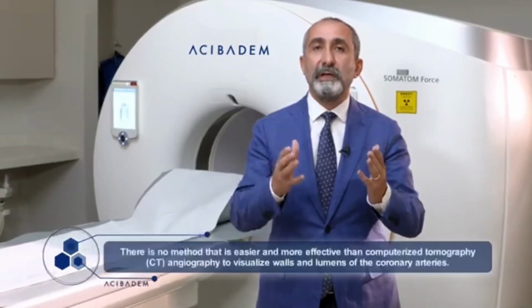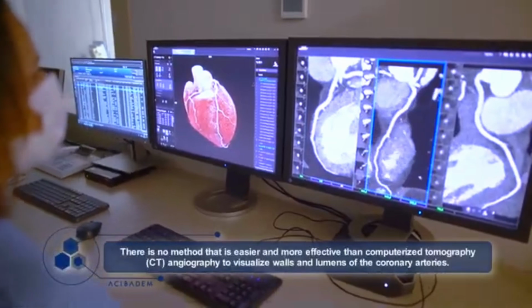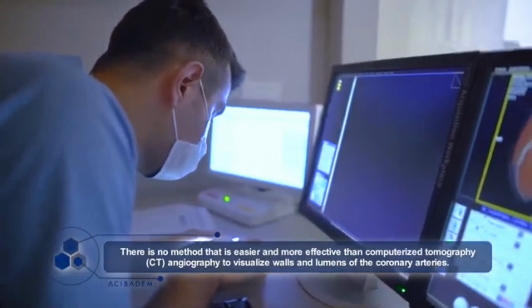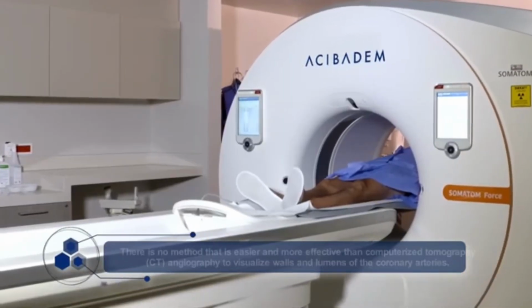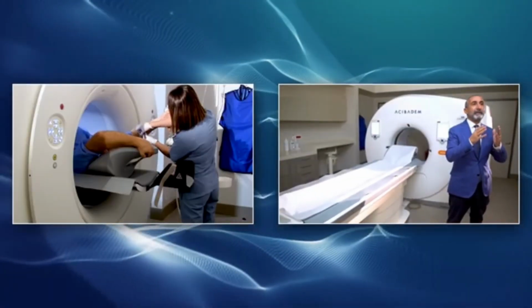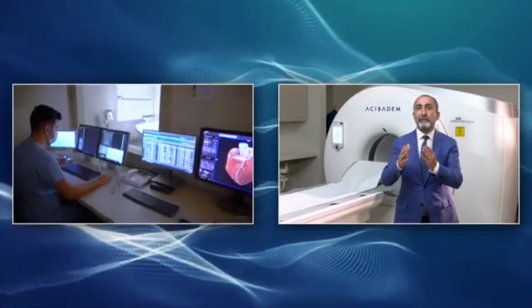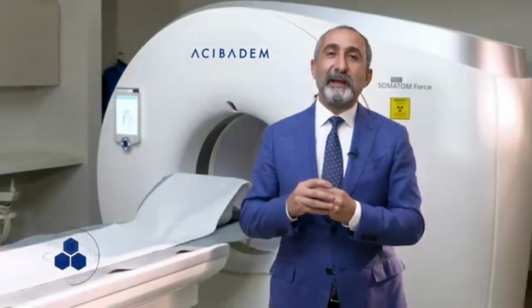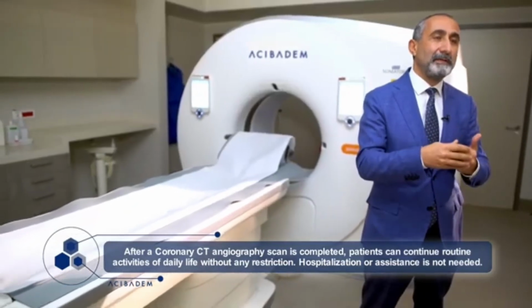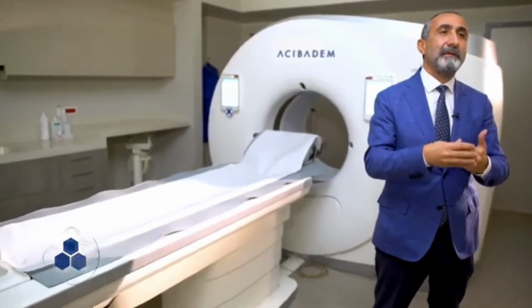In brief, there is no modality that is easier and more effective than computerized tomography, CT angiography, to visualize the walls and lumens of coronary arteries in patients with suspected coronary artery disease. The conventional catheter angiography should be reserved for high-risk patients who have obvious treatment requirements. After a coronary CT angiography scan is completed, patients can continue routine activities of daily life without any restriction. Patients do not require hospitalization or any assistance.